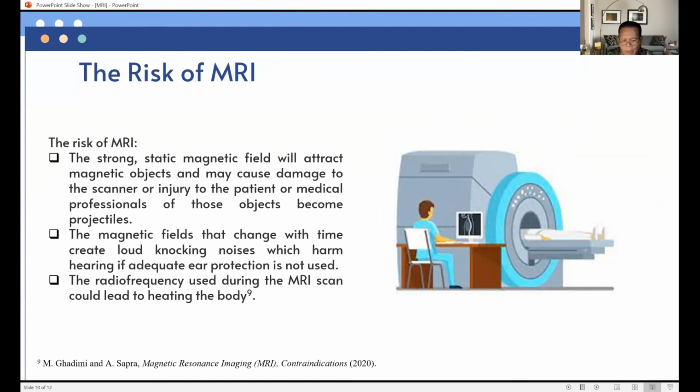Magnetic resonance images are made without using any ionizing radiation, so patients are not exposed to the harmful effects of ionizing radiation. But while there are no known hazards from temporary exposure to the magnetic resonance environment, it involves a strong static magnetic field, a magnetic field that changes with time (the pulse gradient field), and radio frequency energy, each of which carries a specific safety concern.